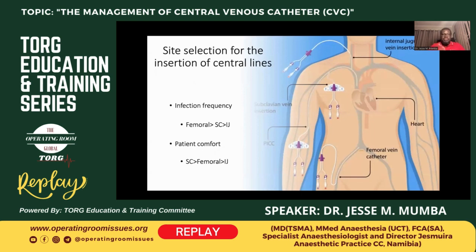So we've talked about these central lines, and I just wanted to say that as far as infection is concerned, when you look at the frequency of where you find most infections, it starts in the femoral. And I think it goes by saying it's a bit difficult to clean the groin, and just nursing care may not be adequate. So the frequency of infection is usually the femoral site, followed by the subclavian site, and then the internal jugular has the least frequency in terms of infection.